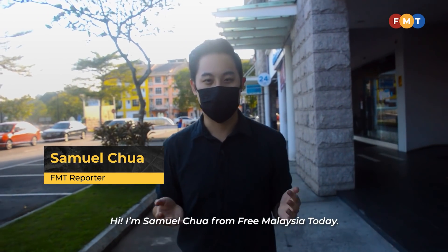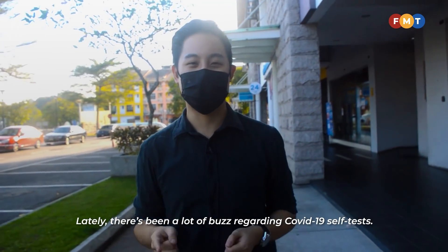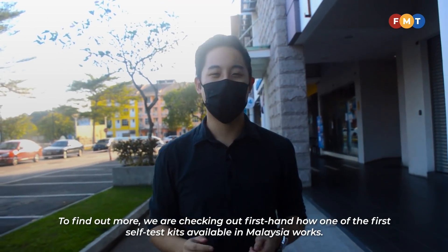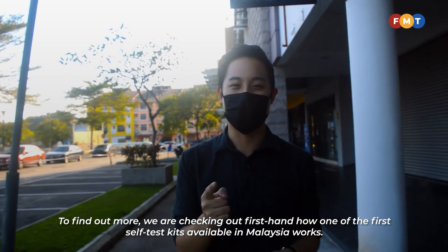Hi, I'm Samuel Chua from Free Malaysia Today. Lately, there's been a lot of buzz regarding COVID-19 self-tests. To find out more, we are checking out first-hand how one of the first self-test kits available in Malaysia works. Let's go!